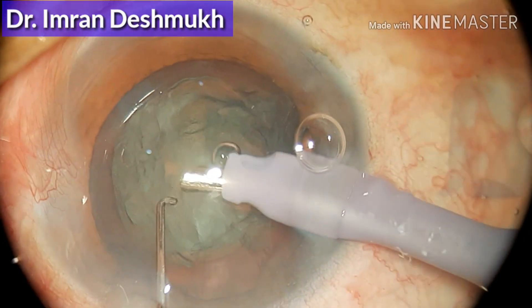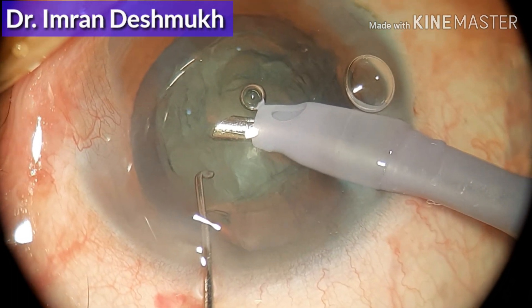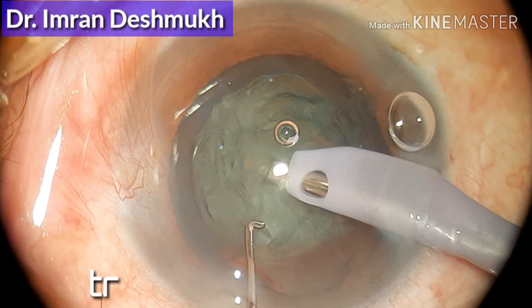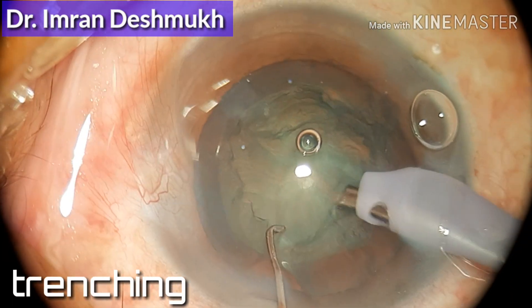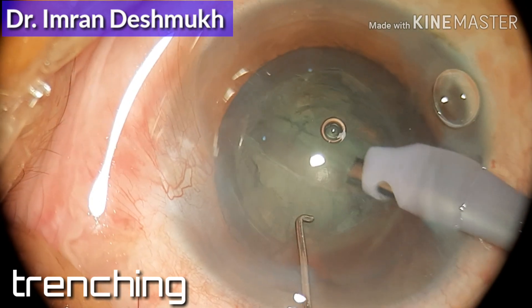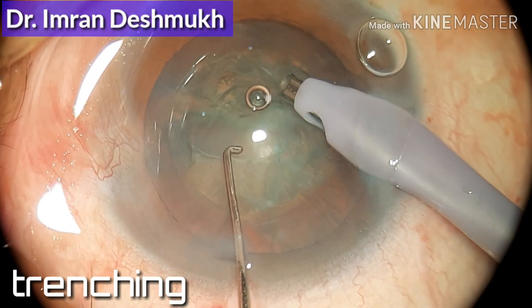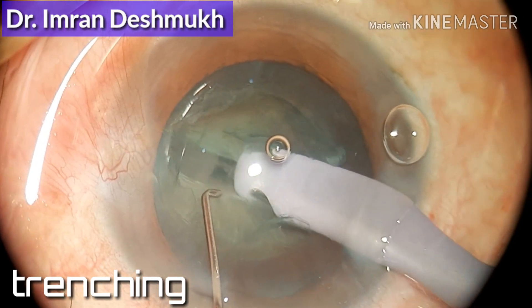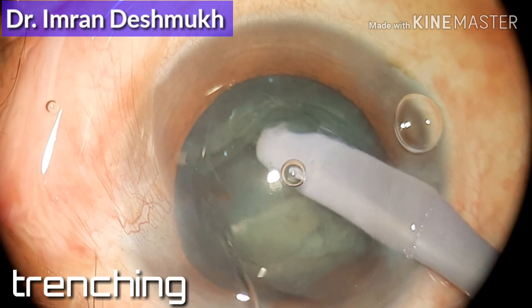Right now in this video, once I introduce the phaco probe through the main wound, I have the Sinskey key in my left hand. After going inside, we should turn the tip of the phaco tip upwards, aspirate a little viscoelastic, and start trenching. Make sure your eyes are on the phaco tip, and slowly trench — don't be too superficial or too deep. Keep trenching till you get to see the red glow, then insert both instruments and try to divide.